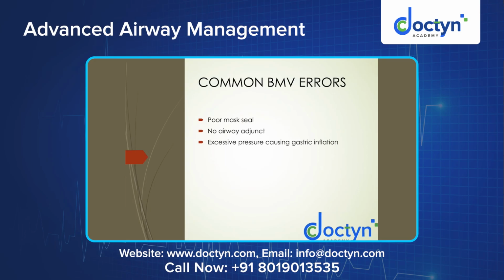And again, sometimes when there is excessive pressure while ventilating, along with the air going into the lungs, it will also enter the esophagus, which would lead to gastric insufflation. So when the stomach gets filled with air, this would lead to increased risk of aspiration, because the airway is just patent, but it is not secured at this particular moment of time. So that's why it is always important to avoid excessive pressure while squeezing the bag during bag mask ventilation. Till here, the bag mask ventilation aspect.